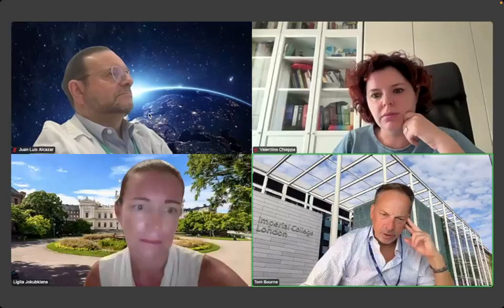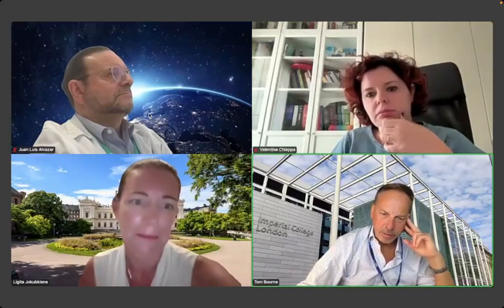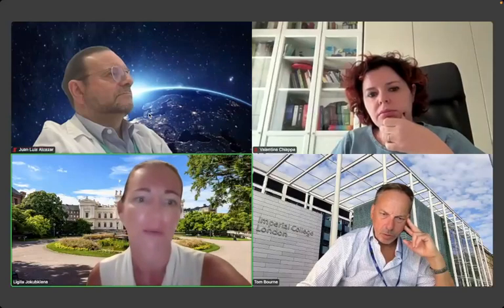And the pelvic assist works the same on any of the probes, does it? Or is it validated on these different probes? Yes, it should work with any probe.